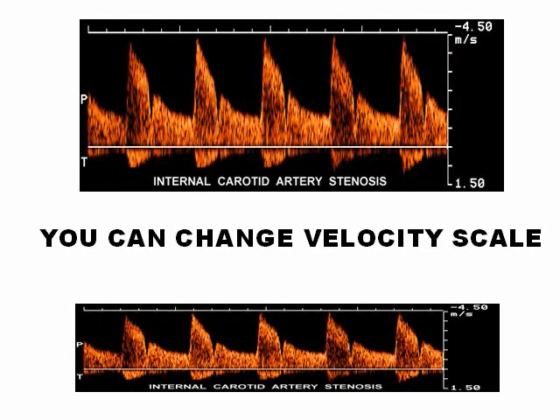You also can change the scale. That means when the wave is too big or too little, you make a better presentation. That does not change the velocity of the blood, it's only the presentation. You make the wave bigger or smaller, but the scale will be the same.